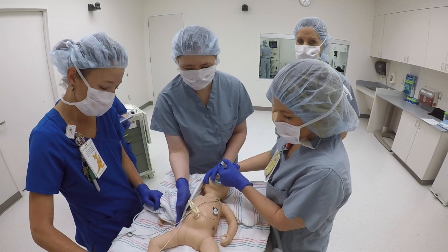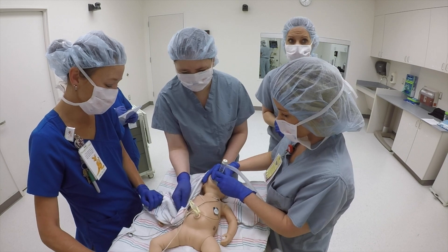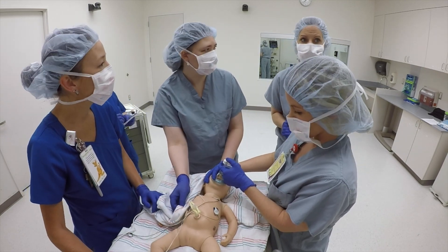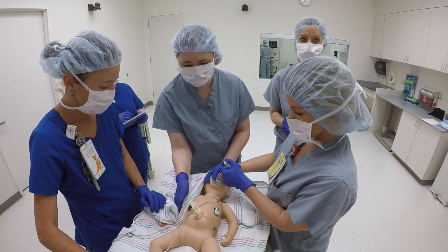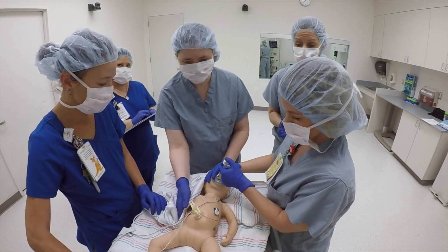We have a 36-weeker that was born floppy and apneic. We have been moving the chest with ventilation. Yes, we've been moving the chest for about 30 seconds now. The heart rate is still not coming up and we've already tried our corrective measures. I think it's time to get an alternate airway. Does everyone agree?